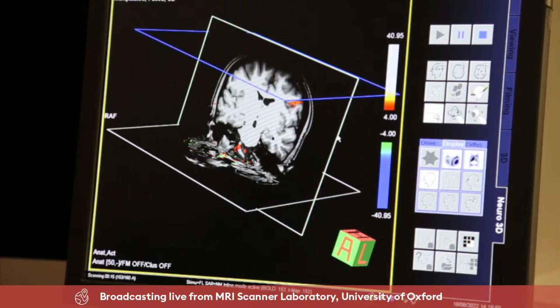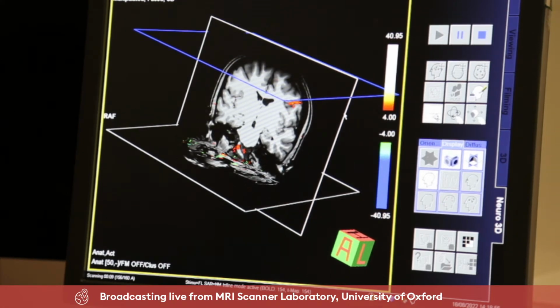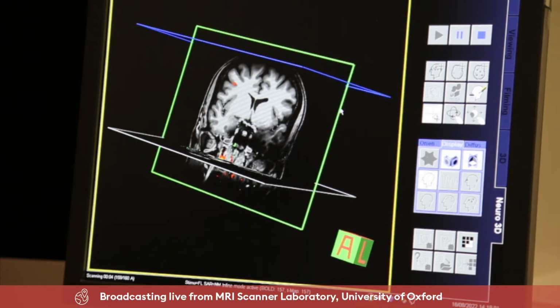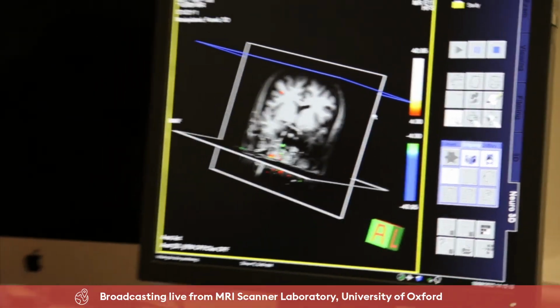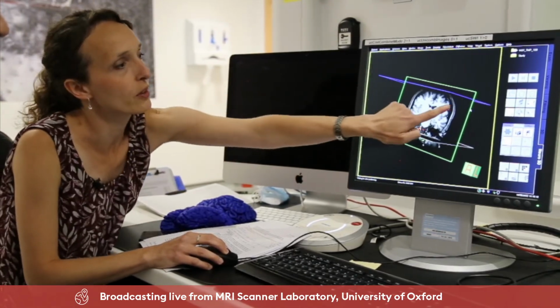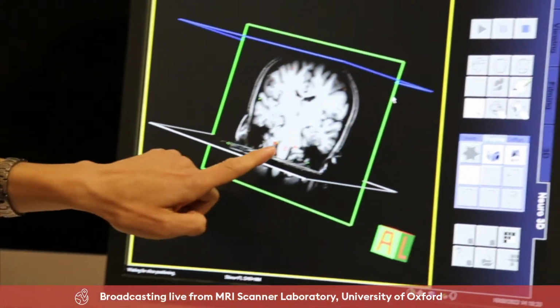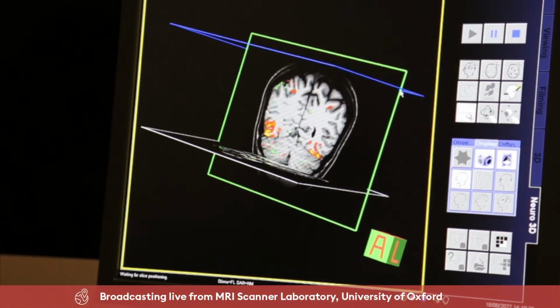There's some sensory motor activation here. That is the part of the brain that makes us plan and think about movements and also the things that we might sense. So she might have some imagination about how it would feel to touch an octopus, for example, or what might make her want to run away from the octopus. That could be why, but of course we're moving into interpretation now, so maybe for now we should stick to just observing. We can definitely observe some activation here, more in sensory motor cortex. We see some activation further down, deep inside the brain, in the brainstem. And then this massive visual cortex activation.